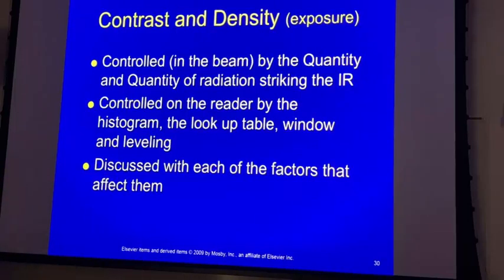So when you change from auto to fixed, you're taking the lookup table off? Yeah, exactly, the lookup table. You're not taking the histogram off, no. You've still got a histogram, but you're taking the lookup table off. So when you make your exposure and you get that unprocessed image, that's what it's doing.